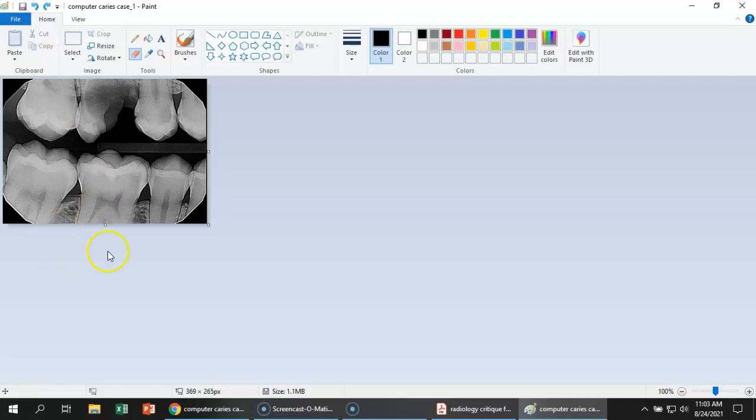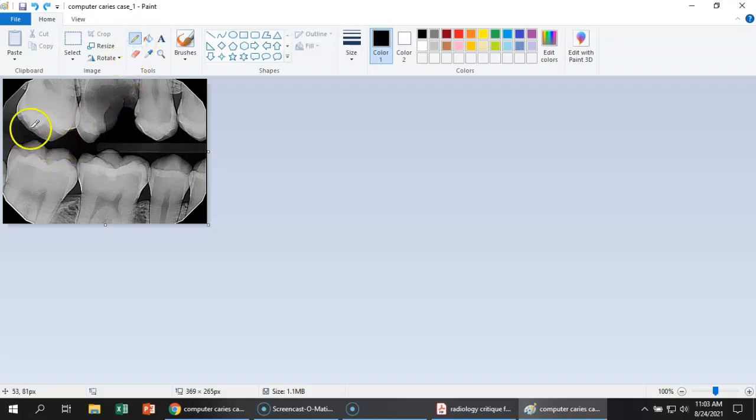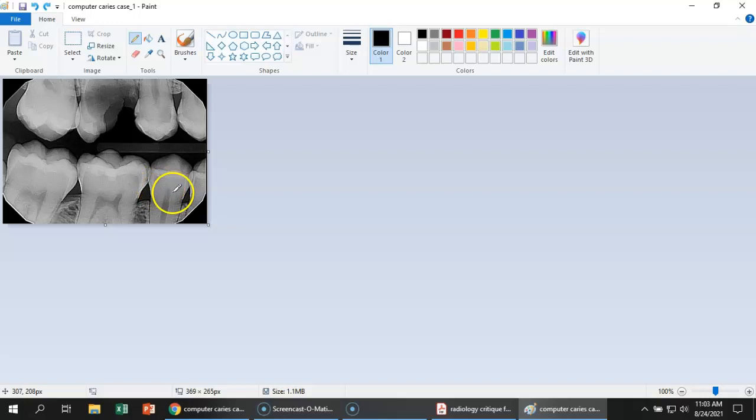Now we'll look and say, do we have a vertical angulation error? Well, no, not really, because these cusps aren't really overlapped over each other. So there's no vertical angulation error. What about beam centering? Do you see any beam centering error? No, I don't see beam centering.